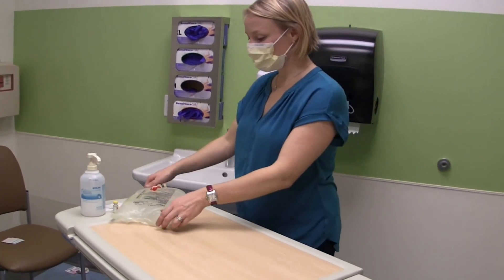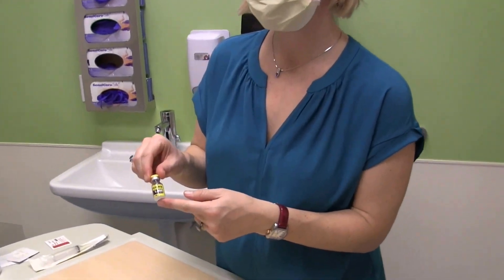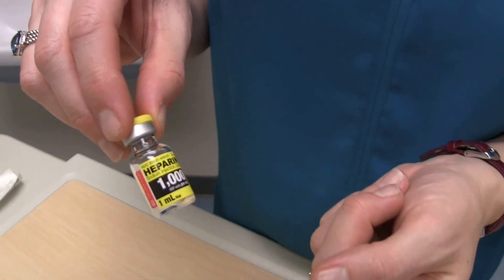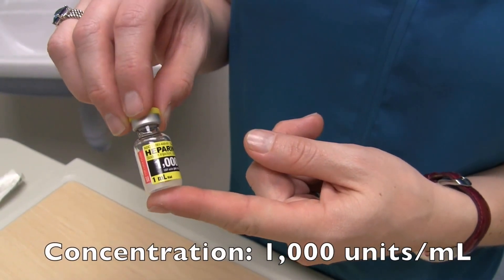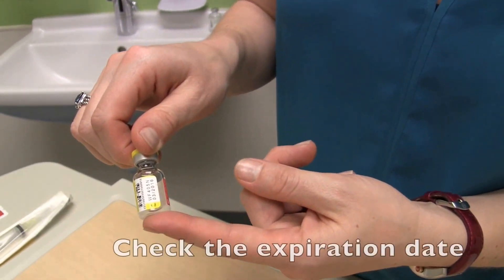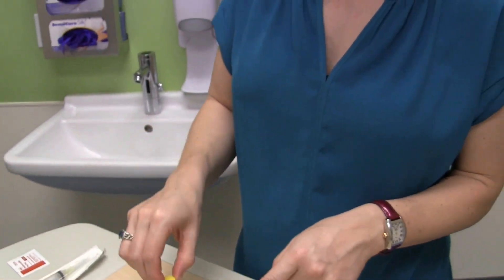She confirmed that I have the right concentration of heparin — a thousand units per milliliter. This is a one milliliter vial, so once I'm done with it I'll throw it away. If it was a multi-dose vial, it would be good for 28 days from the day I open it. I'm also going to check the expiration date of March 2016, so we're okay to use this one today.